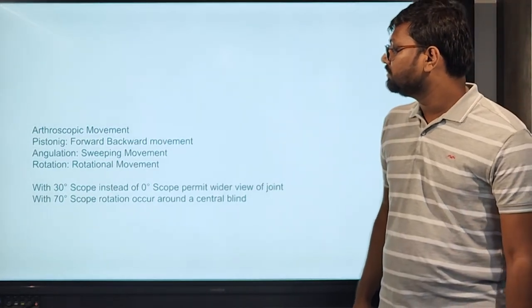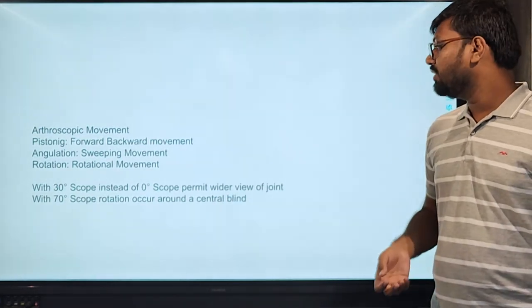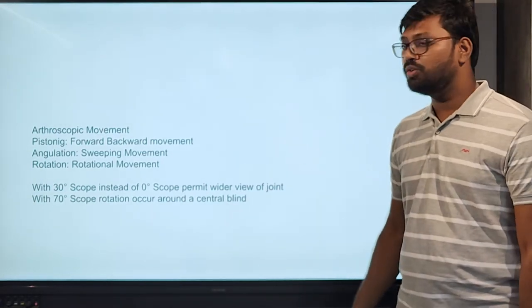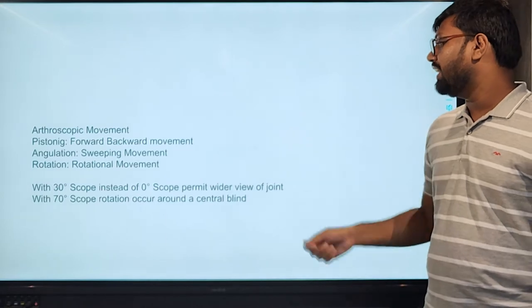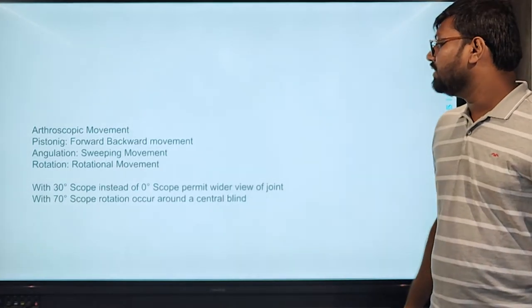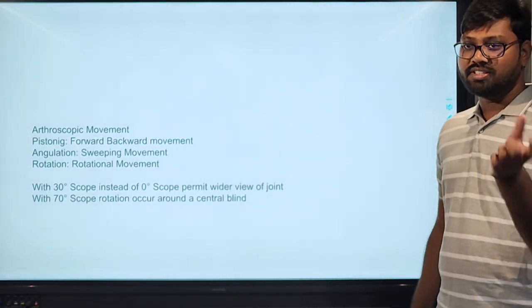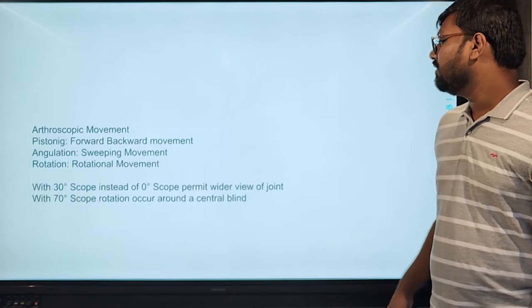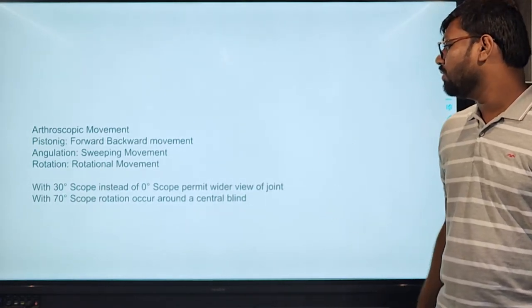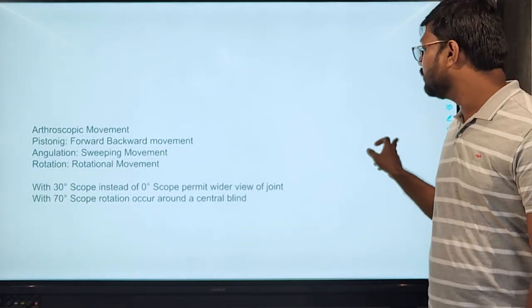unlike circular portals. The arthroscopic movements are the pistoning movement, forward and backward, to go to the point we want to view, and zoom in, zoom out; the angulation to cover more surface area and view area; and the rotational movement to view the surrounding structures of the lens. The 30 degree scope, instead of the 0 degree scope, permits a wider field of view, and with the 70 degree scope, rotation occurs around the center blind spot.